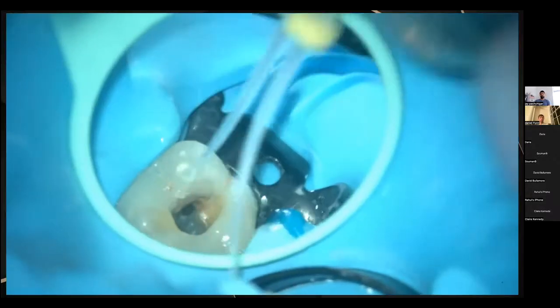So I took a 25 mil, I think, metal needle. The video's not terribly in focus, but all the canals were about 24 mils. In the distal canal, we are getting about 22 mils, so that one wasn't too bad. Same in the palatal, about 23 mils. But on that MB root with that sharp curve, we're only getting about 15 or 16 mils into that canal. And again, all that debris which your file has made is just not getting removed.